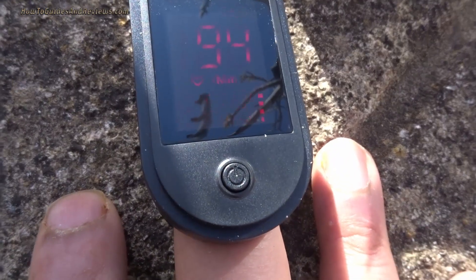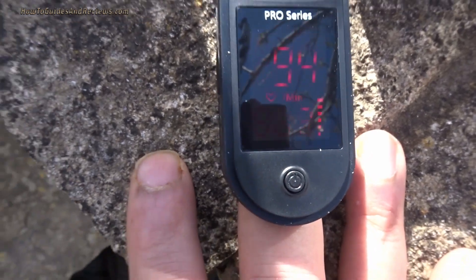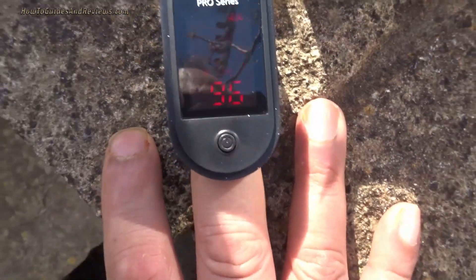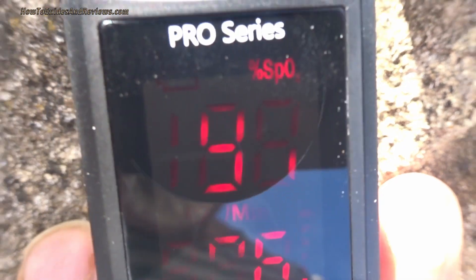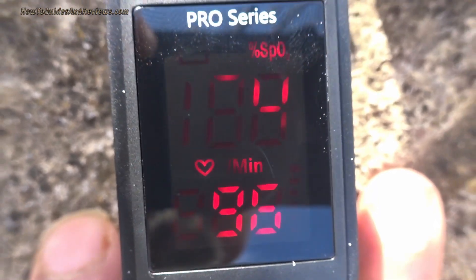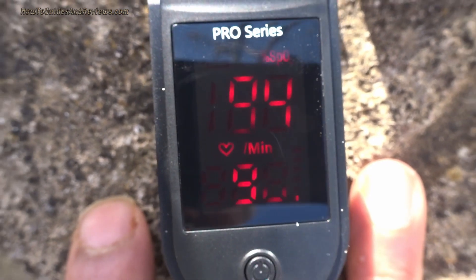The bottom reading is heart rate. So it looks like I've got a 94% oxygen reading and my pulse is 96 — a bit high. It should be 98–100%. It's a bit low. Let's try it with someone else and see what happens.